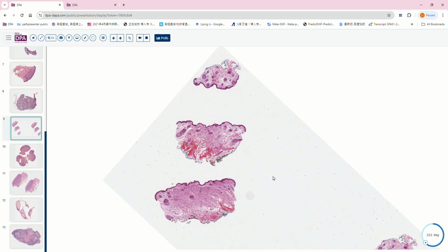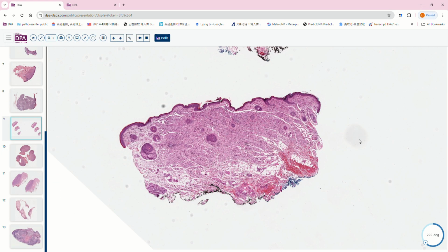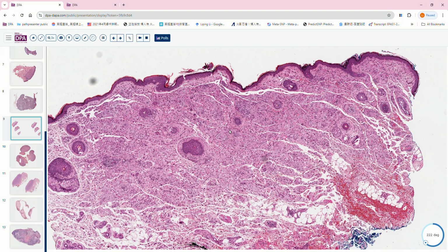If we select these three pieces, I just remember that I was including them. Lesions, so I would just pick the last one. Yeah, this one. I would say usually it's a superficial damage, but it kind of trickles down into the deeper dermis as well, but the lesion is mostly in the dermis. So it's just high power, honestly. And also the thing to notice is more like an eosinophilic thing.